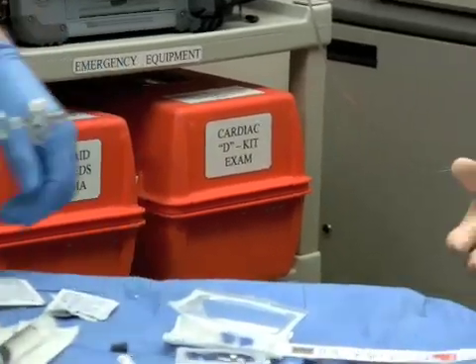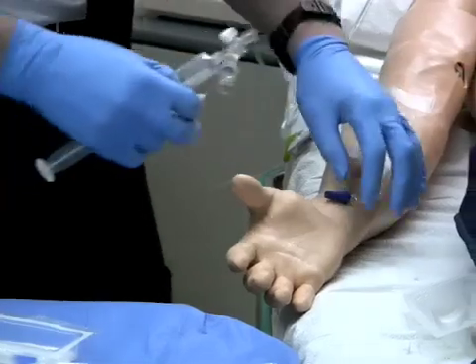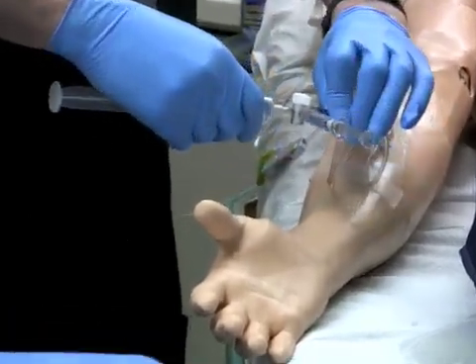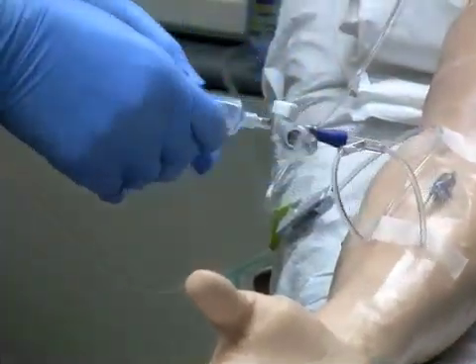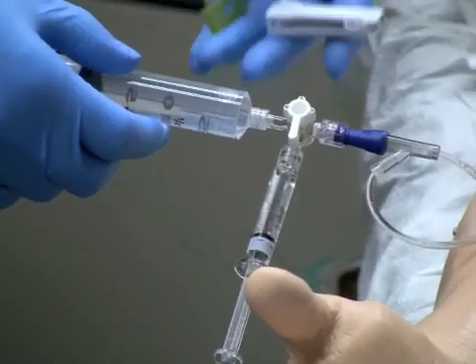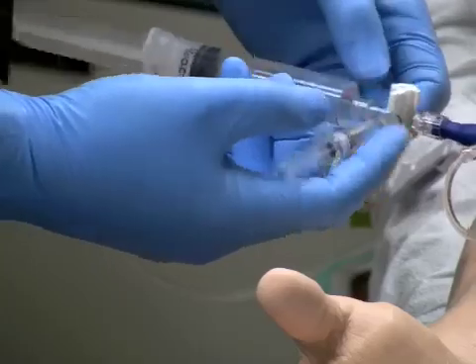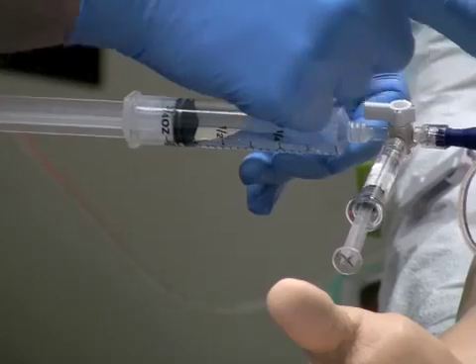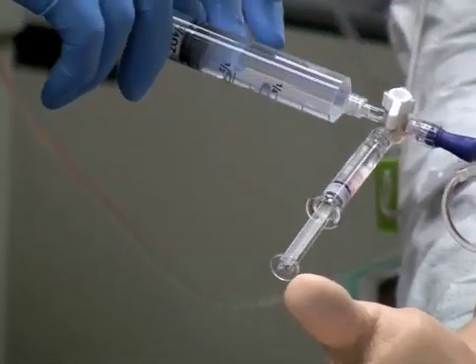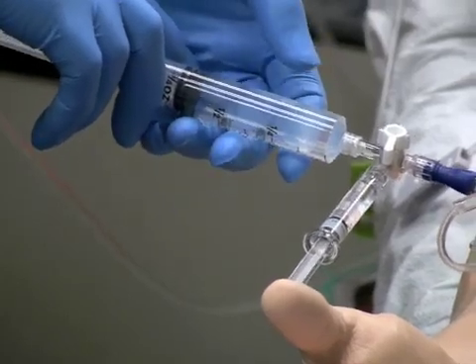To demonstrate: the patient presents, still fine. Reassure them, clean the area, attach the device. Make sure it's all secure because it's being given under pressure. We know that the back check valve works. If there's a bubble or whatever entrained in it, you can either shut it off with the slide or with the lower one here. Open the channel — that goes from there to there. As soon as I push that, I'm going to roll that down, open the channel through, and flush through. This has proven superior to load the bolus towards the heart than squeezing the IV bag, which is why we go to a high pressure device like this.